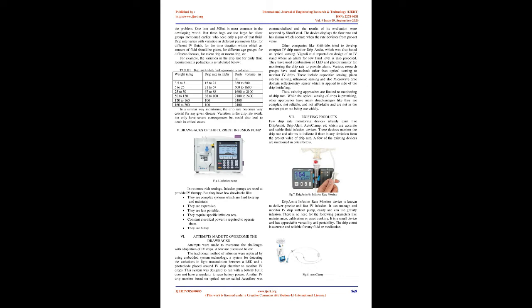Medication error may lead to under-infusion or over-infusion. For some drugs whose therapeutic levels are close to their toxic limit, administration of this type of drug might lead to suboptimal therapy or have toxic side effects. Under-infusion is the situation where less fluid than intended is delivered to the patient. Under-infusion may result in the following consequences: dehydration, metabolic disturbances, a delay in response to the medication.